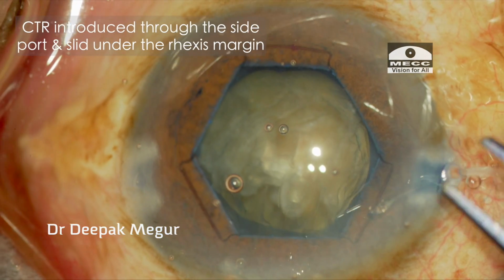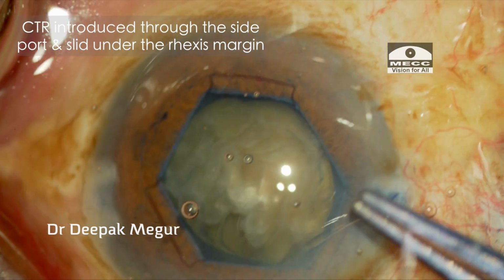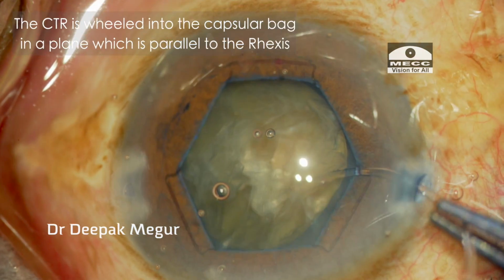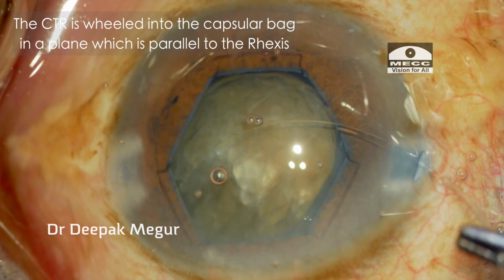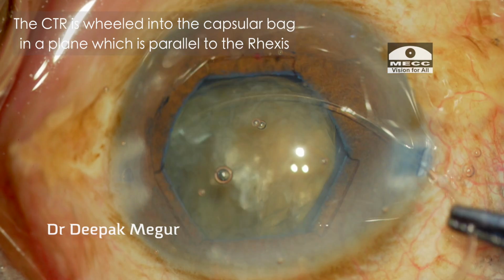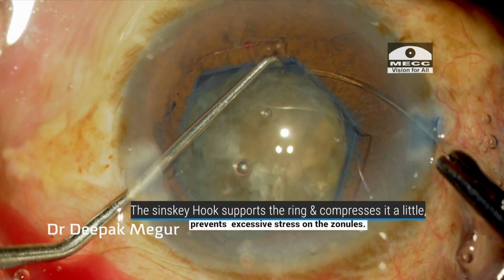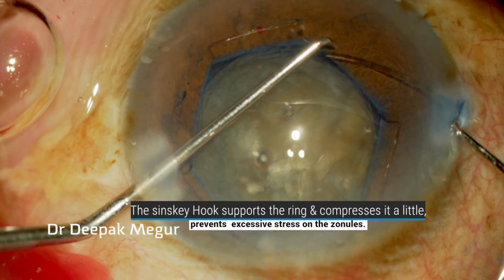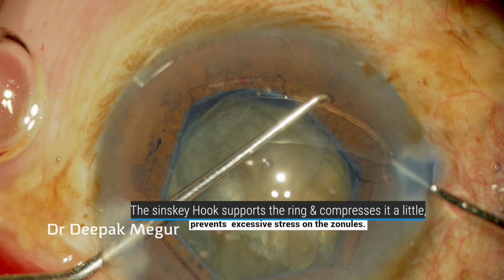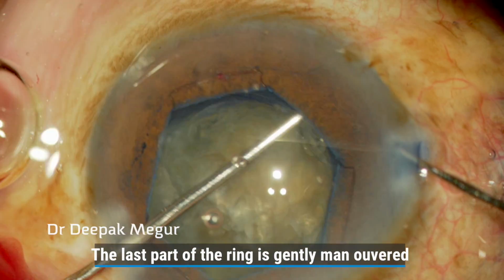The CTR is then gently threaded under the rhexis margin. Care is to be taken that the terminal edge of the ring is not vertical but lies flat and parallel to the anterior capsule. This ensures that the ring will not distort the bag during insertion. Again, the Sinskey hook in my left hand compresses on the ring to ensure that the stress is minimized. It comes in handy to compress and gently guide the remaining portion of the ring under the rhexis.